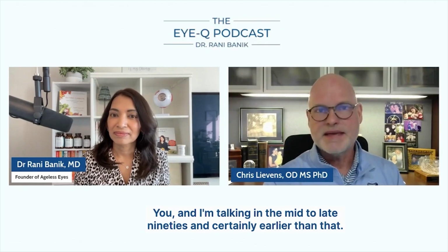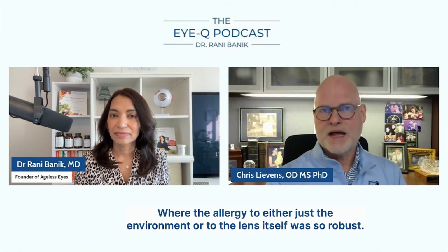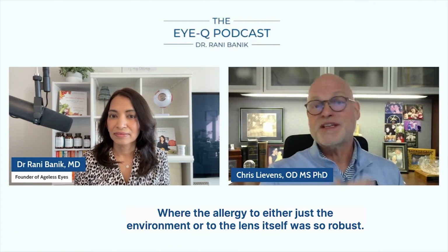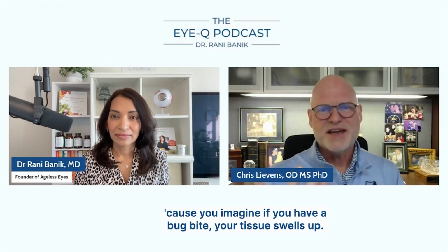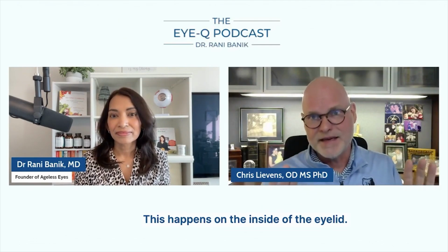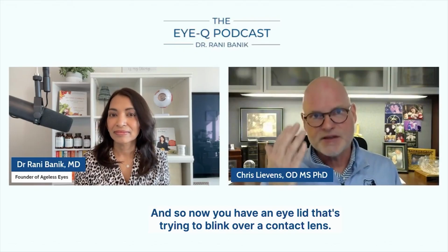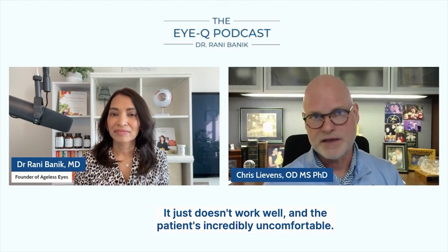I'm talking in the mid to late 90s and certainly earlier than that, and then approaching the early 2000s, where the allergy to either just the environment or to the lens itself was so robust. Because you imagine if you have a bug bite, your tissue swells up. This happens on the inside of the eyelid. And so now you have an eyelid that's trying to blink over a contact lens, but instead of looking like a smooth pane of glass, it looks like a cobblestone street from the 1700s. It just doesn't work well, and the patient's incredibly uncomfortable.